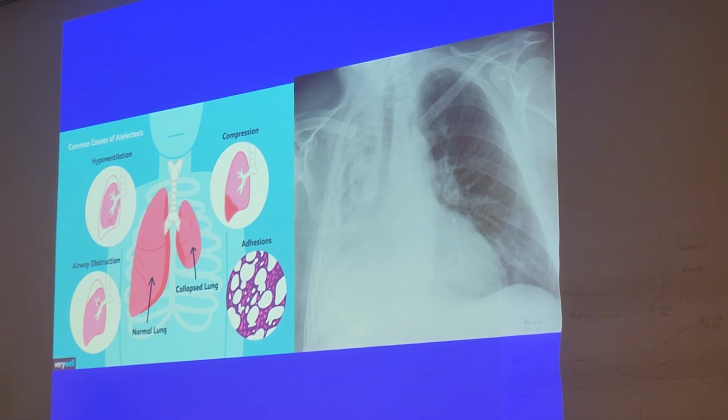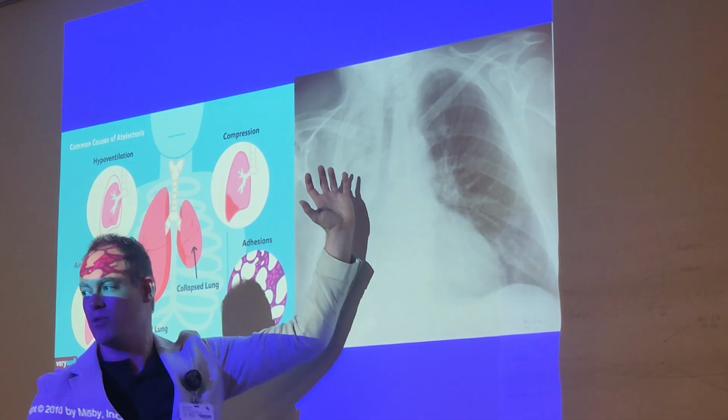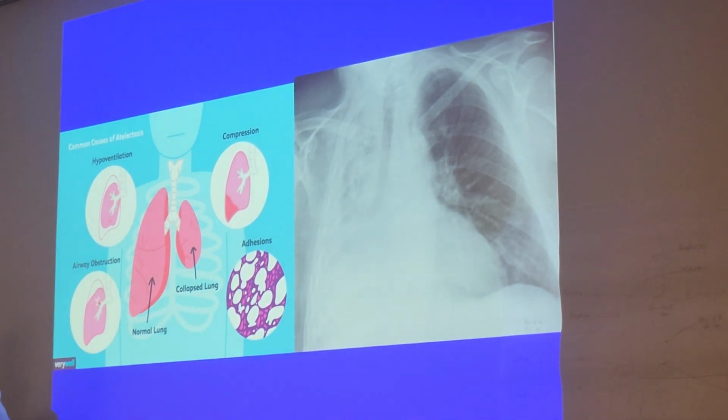You can kind of see where the bifurcation is taking place as well. There's the trachea, there's the carina. As you can see, there's nothing there. You can barely make out a little bit of air, but it's essentially a deflated balloon that you're seeing. Like in pneumothorax, you can see a lot of black, because there's more air causing the collapse. In a pneumothorax, you would see a layer on the outside here, pressing up against what's left of the lung. So this is probably a collapse or something else. It doesn't have to be pneumothorax that causes collapse. That can be another issue. It can be a punctured lung, whatever. Someone gets stabbed with a knife, that can cause a collapsed lung.